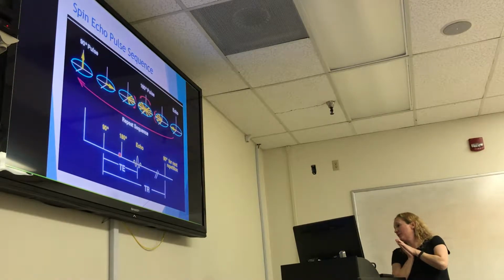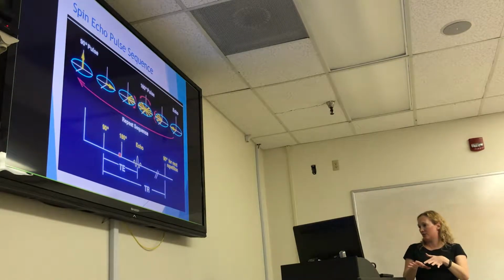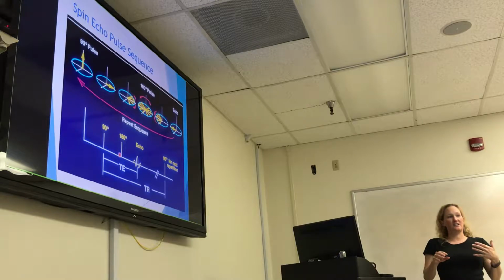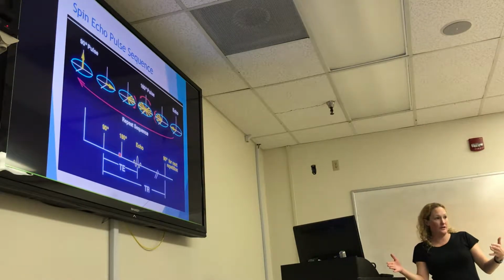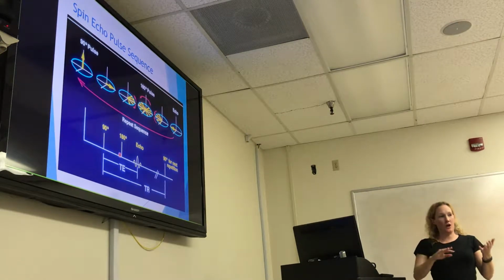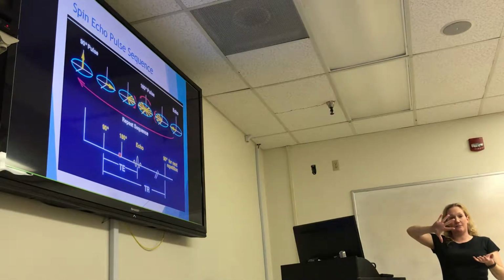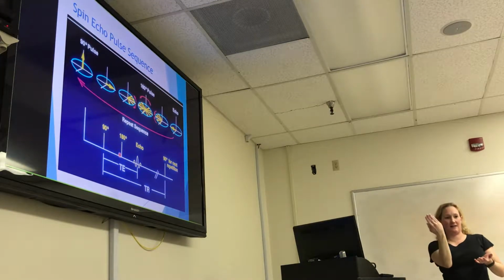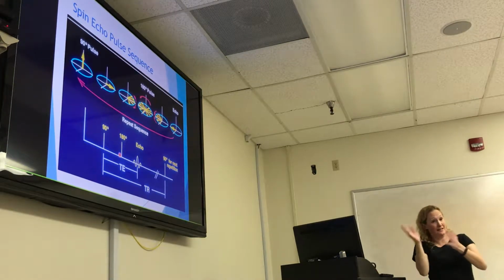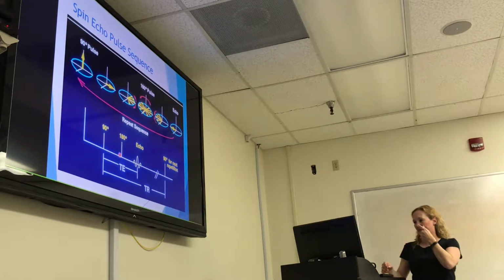A question from the homework, some clarification on what trailing and leading edge are. Got a bit confused with what it's referring to. Okay, so when the dephasing occurs, right, it's because some of them speed up and some of them slow down, right? And so the fast ones get ahead, that's your leading edge. And then the slow ones get behind, that's your trailing edge, okay? So they kind of fan out like my fingers, but then I flip it and they come back together. And so then when you flip it, the trailing edge becomes the leading edge, and the leading edge becomes the trailing edge, and they all come back together. So that's what the book was talking about with the leading and trailing edge thing.